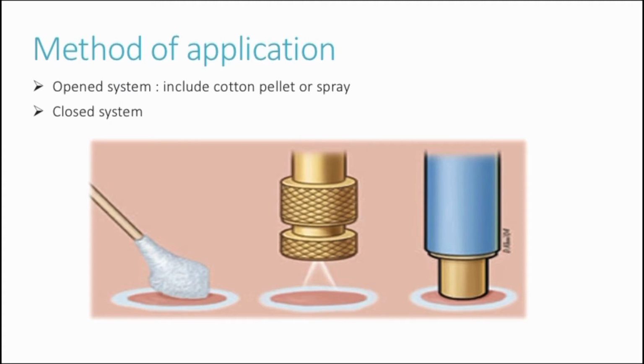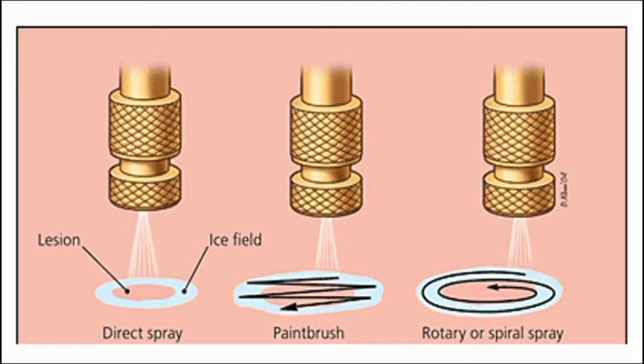Cotton bud is the same as the swab, and the spray can be applied in different ways such as direct spray, paintbrush or spiral spray. Spray and swab are more acceptable to clinicians but not suitable for use in the oral cavity. It is not suitable because of the lack of control over the temperature achieved within the cell and the area of freezing, which makes them hazardous to use intraorally. In addition, rapid evaporation of the liquid nitrogen from the cotton swab requires numerous applications on the lesion.